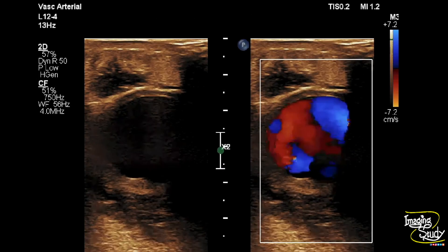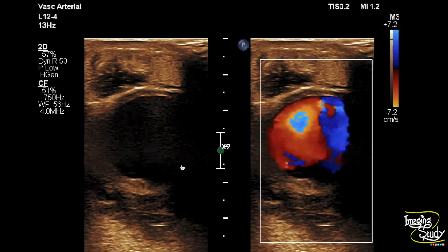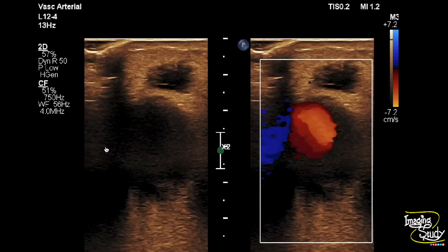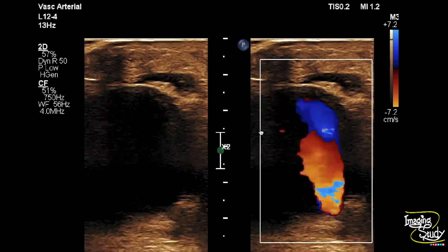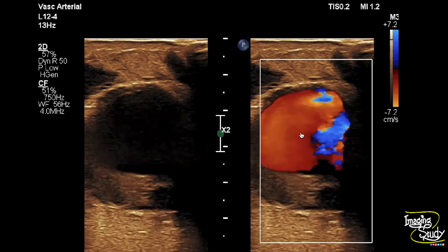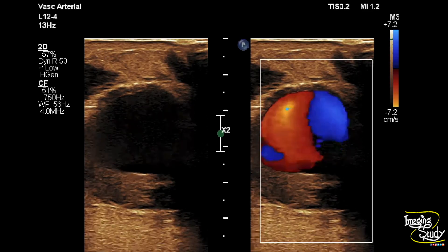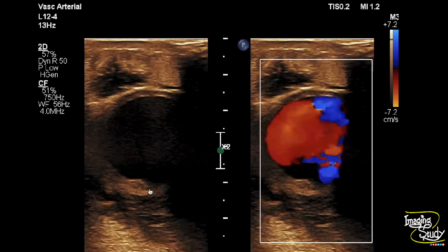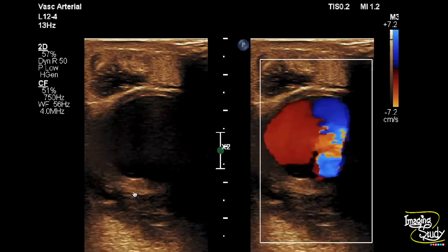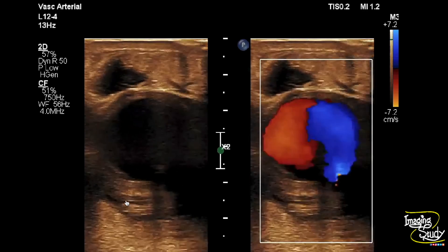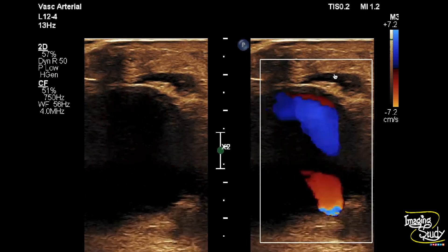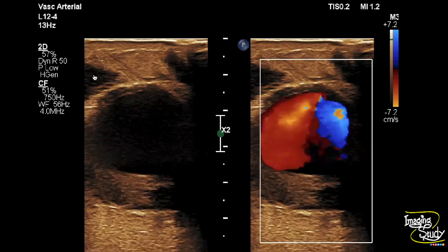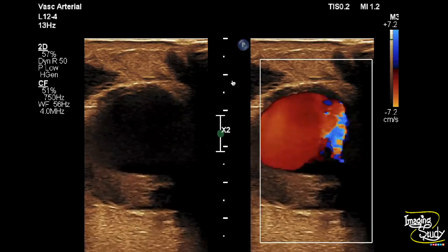Here you can see the high-frequency superficial view of the right groin showing a round cystic pulsatile area on the left image, and on the right one there is a pepsi sign or yin-yang pattern of flow within this cystic lesion. This cystic area is the aneurysmal dilatation of the superficial femoral artery. The lumen shows an irregular hypoechoic thick area indicating mural thrombi. The subcutaneous layer is edematous with some irregular heterogeneous hypoechoic area — the adjacent subcutaneous tissue swelling is due to inflammatory process, and this heterogeneous area is the hematoma.